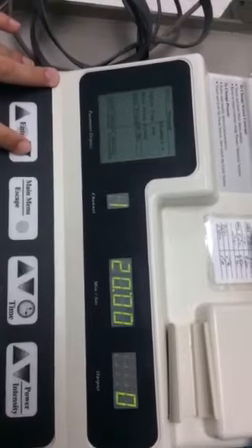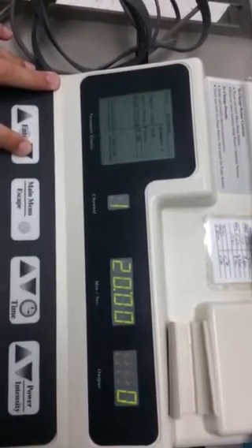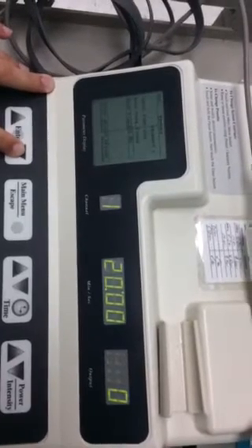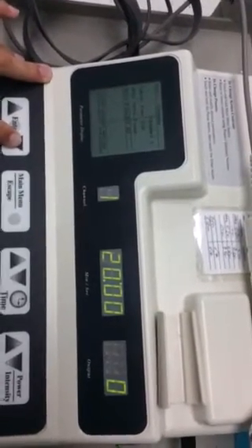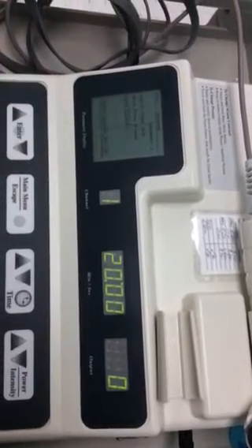So I'm going to use a fine motor. I'm going to set it at 50. 50, right? Not 60. Okay, yeah, it's between 30 and 50. So I'm going to set it at 50.